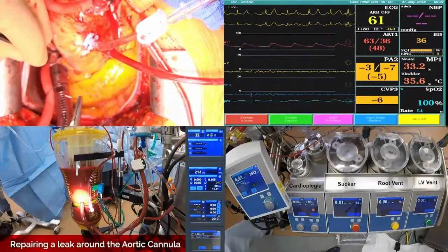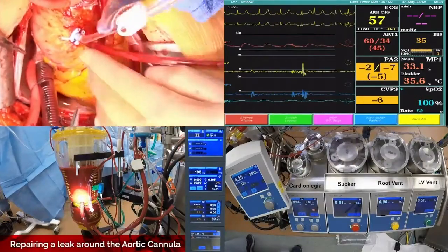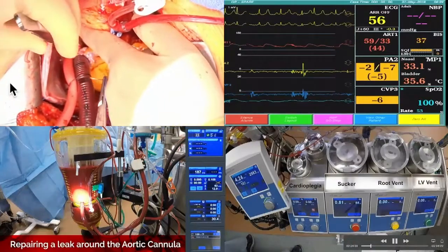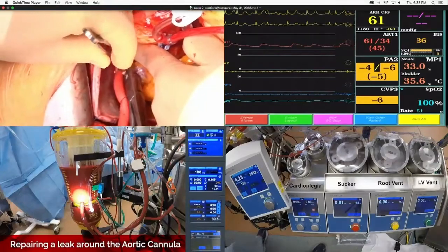All your different pressures that you're looking at, what that middle module is showing? Here, sure. We haven't given cardioplegia or anything. Look, this is working. Here, hand them that. Don't click anything, though. You get in a lot of trouble.